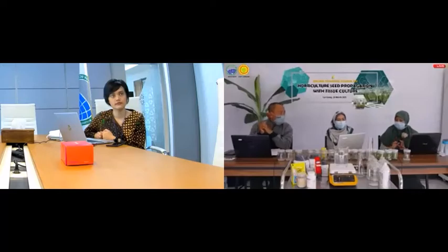That's why we always use alcohol. I think there's a question about the alcohol. Why do we use 70% alcohol? Because we want to sterilize all of the things that we're going to use in the tissue culture work. Yes. Thank you.